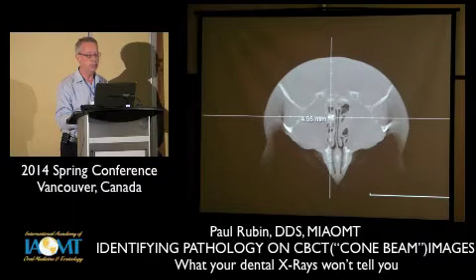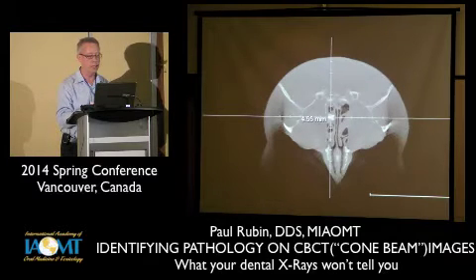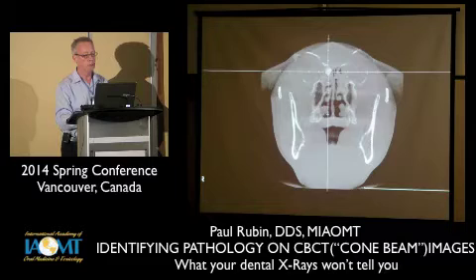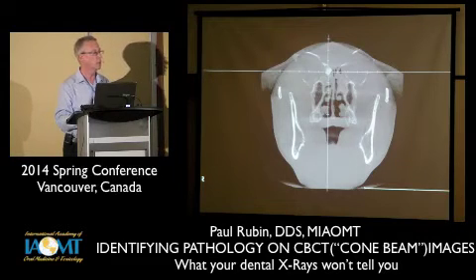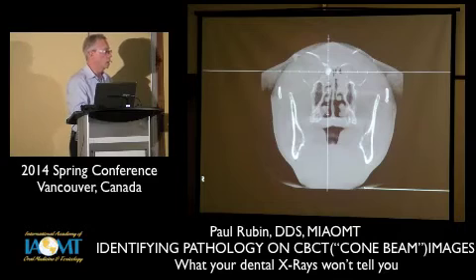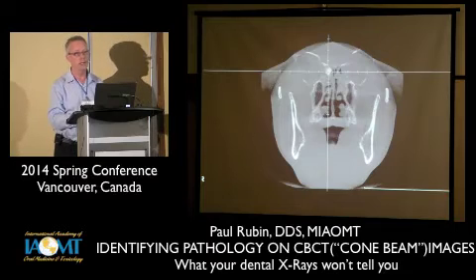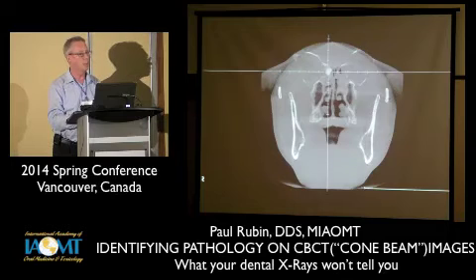Back to the case I showed you before where this radiopaque area showed up in the ethmoid sinus area. Again, I measured it. You can look at it in all the different dimensions. Send this off to someone who can interpret this. One of the values of this is that there are services who can read these images for you. Radiologists. If you don't feel you know enough about all of the structures to be able to give a thorough reading of the entire image, not just the teeth, you can send the image off to a radiologist.